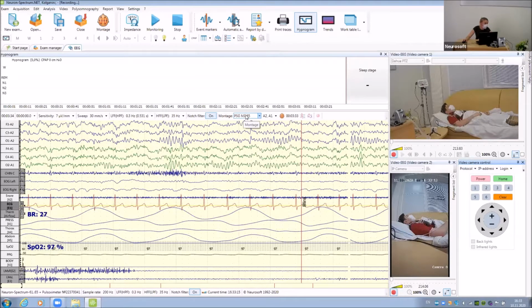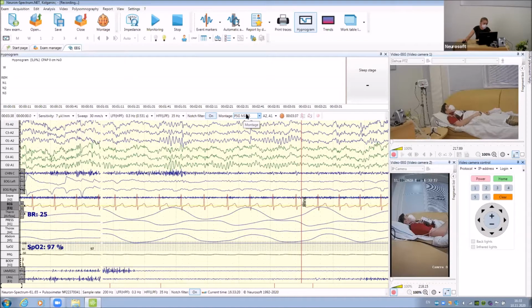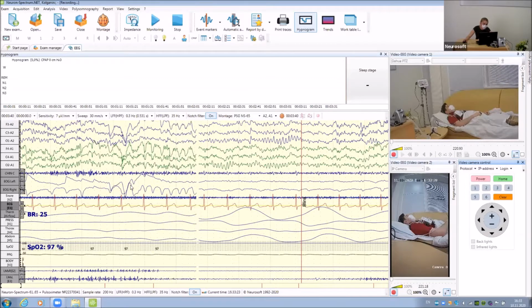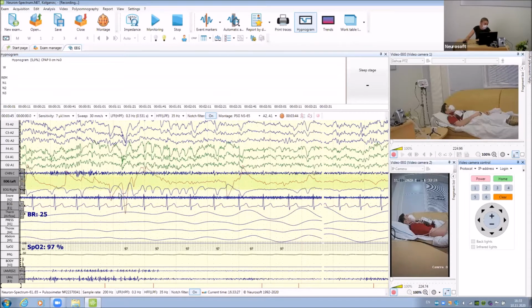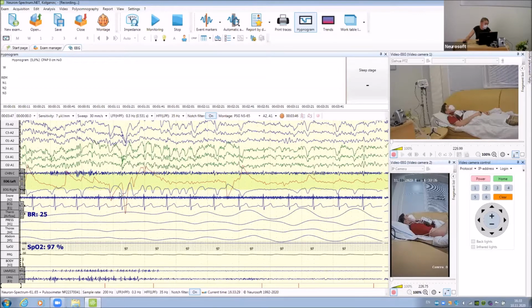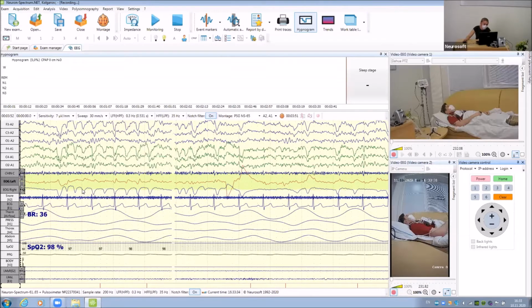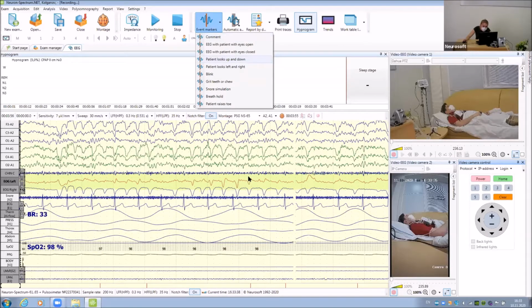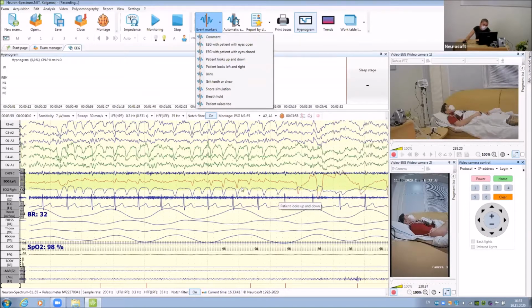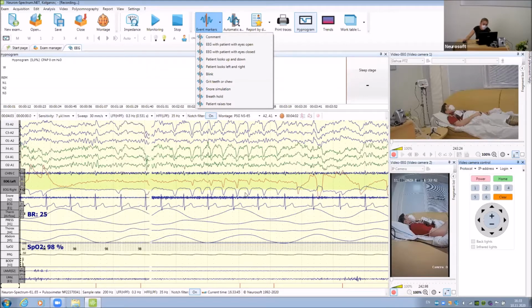Now we ask our patient to blink. Anton, blink, please. Thank you. It's not very high amplitude. Please blink again. Here we can see the blink. Here they see the blink. Thank you. Close the eyes. This is an in-phase deflection here.